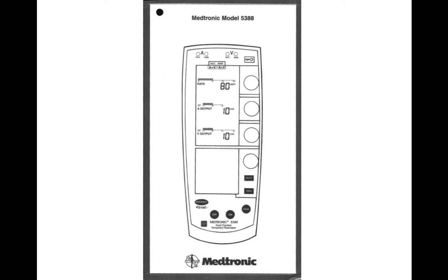It has a very simple interface. There's the rate knob right here, and that's adjusting your rate. When you turn on the device, it defaults at 80, 10, and 10 — as far as your rate and your milliamps for atrial output as well as ventricular output.